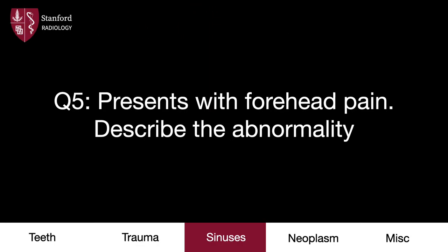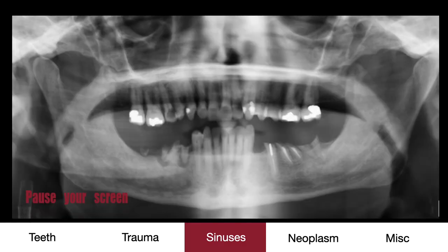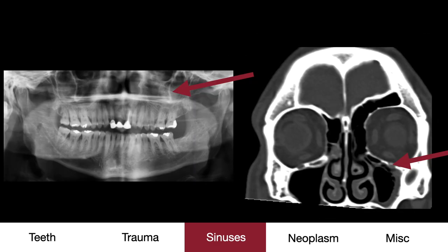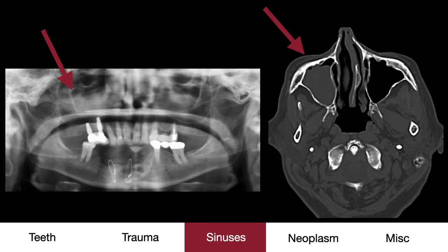Our next category is sinuses. In case five, we have an individual presenting with forehead pain. This panorex shows poor dentition with multiple dental caries and periapical lucencies. Note that there is asymmetric opacification of the left maxillary sinus relative to the right. This patient's forehead symptoms were likely due to referred pain from this region. Follow-up CT confirms our findings. This is a more subtle case of maxillary sinusitis on the left.